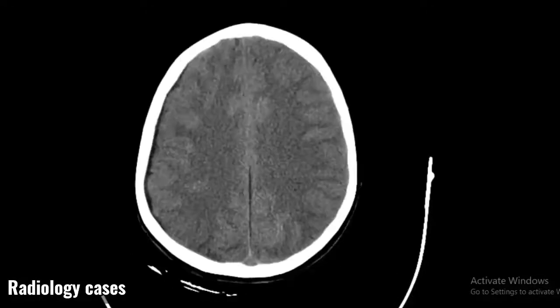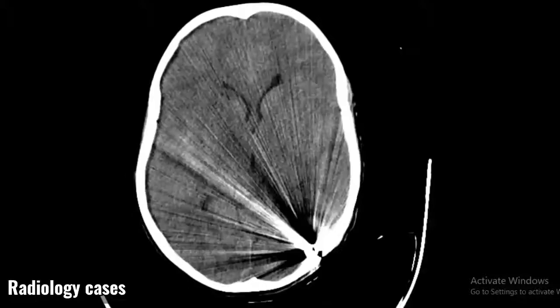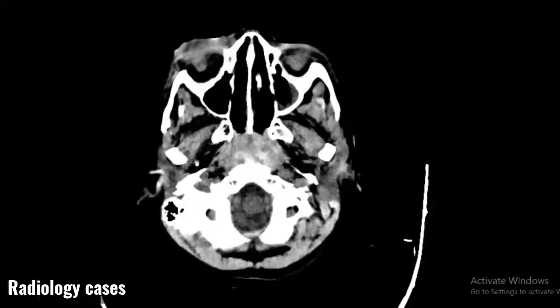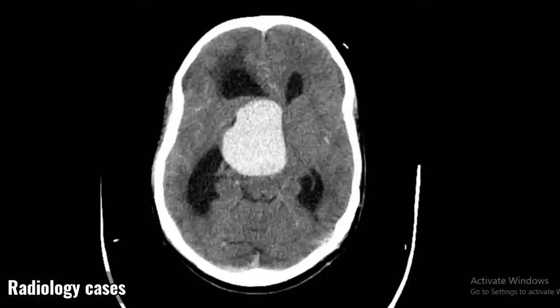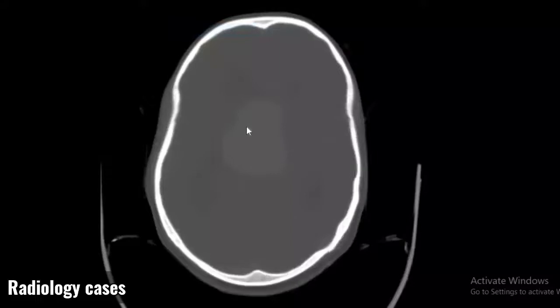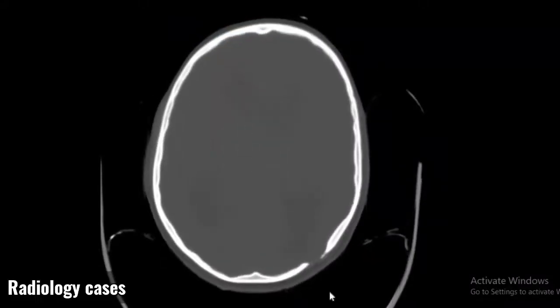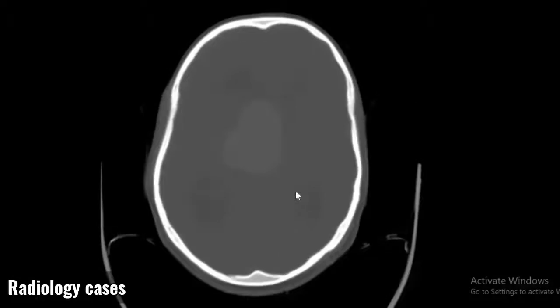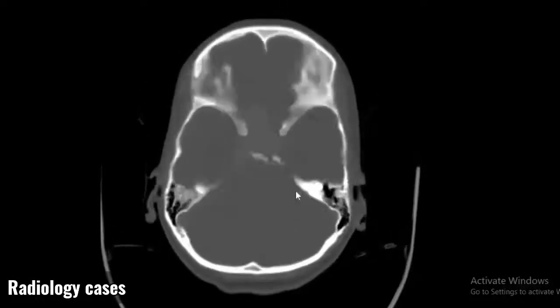Our case impression is a large suprasellar pseudoaneurysm with intrasellar and parasellar extension and mass effect causing moderate obstructive hydrocephalus plus significant subfalcine herniation to the left. NB: The previous image showed acute post-traumatic changes with hemorrhagic contusion, subarachnoid hemorrhage, right eye collapse and a metallic foreign body in the left parieto-occipital region, so the pseudoaneurysm is likely a complication of the previous trauma's deep wound.